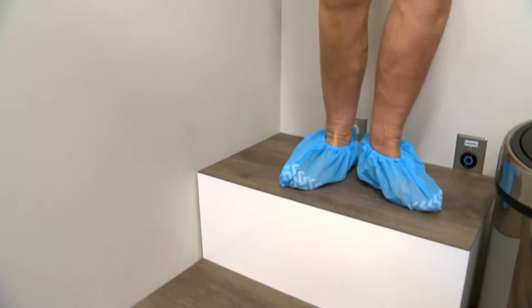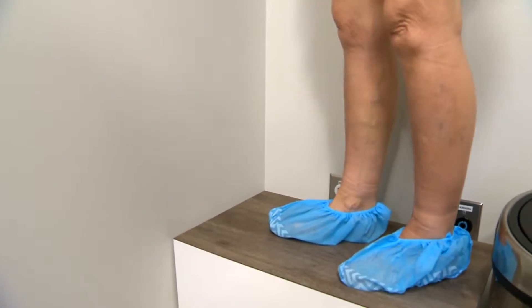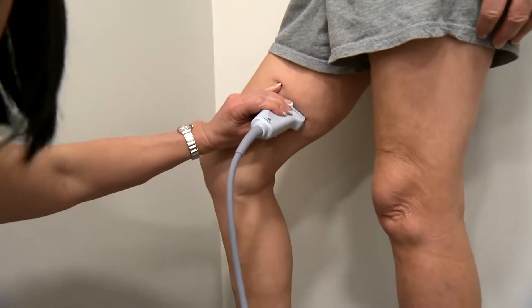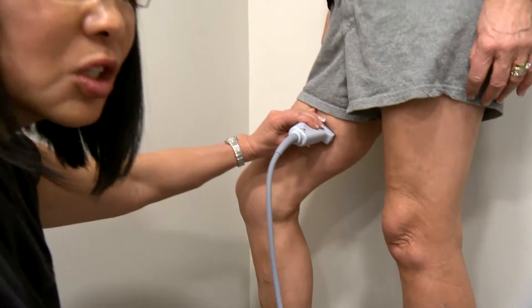This is a demonstration of ultrasound-guided foam sclerotherapy to treat this patient's large bulging veins. We look for the highest source of pressure causing the visible varicose veins. This is best done using an ultrasound to look at the underlying veins that may be the cause of the problem.